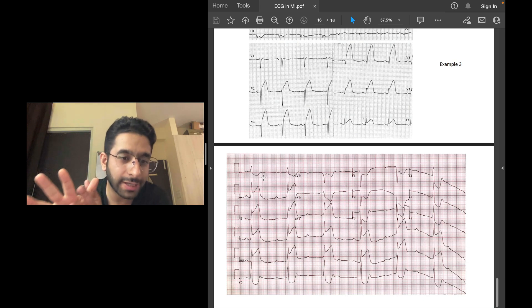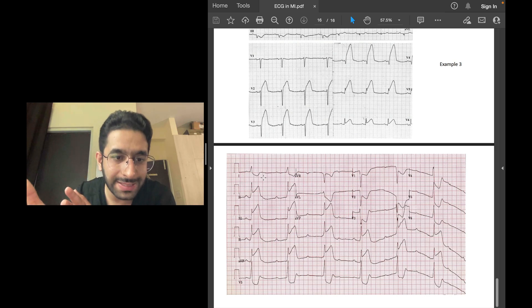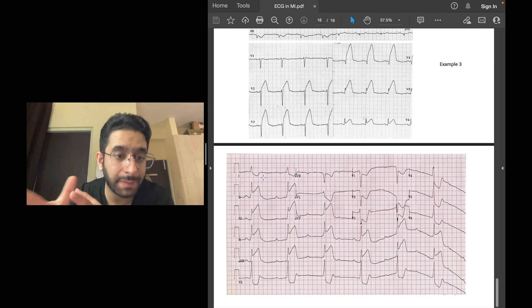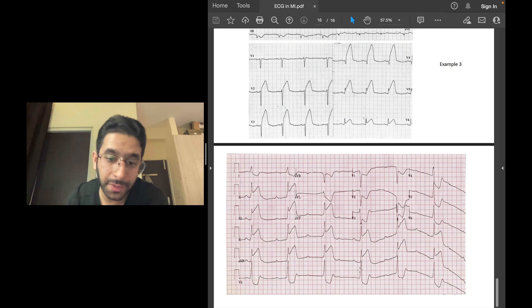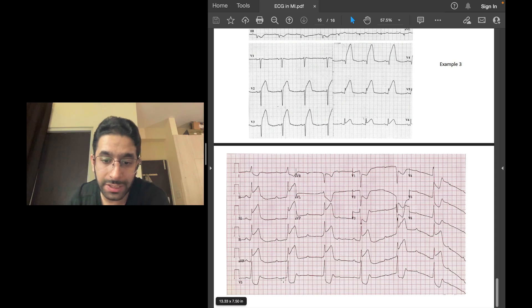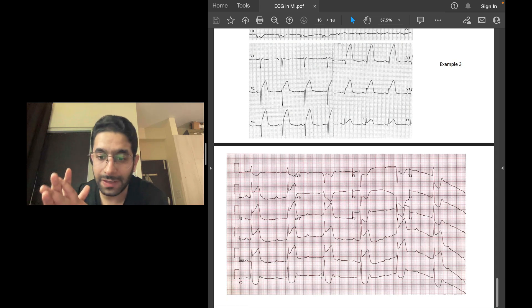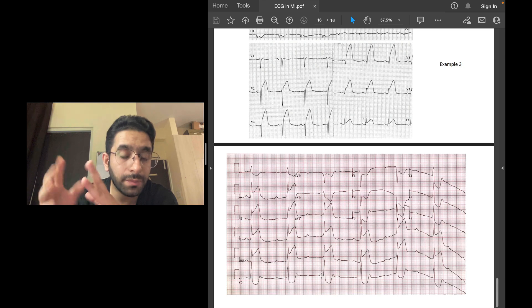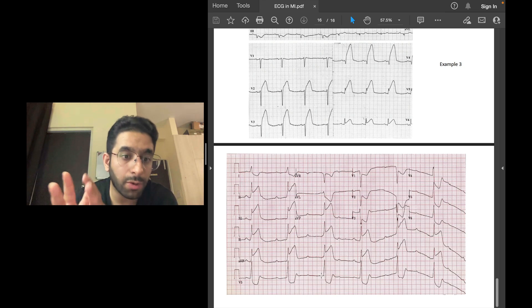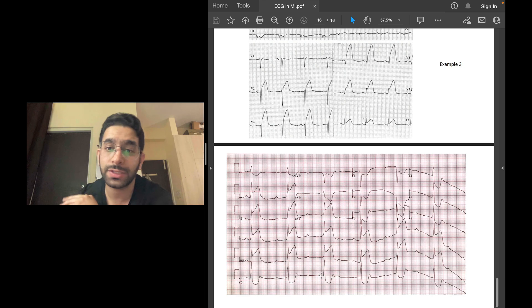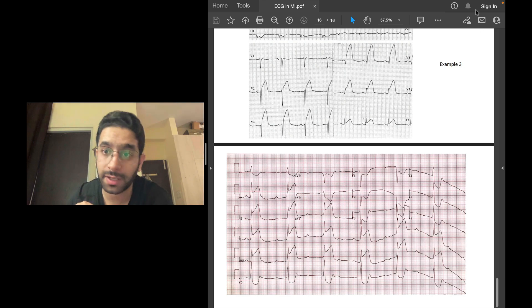The last ECG example is important. You can appreciate ST elevations in leads 2, 3, and AVF with depressions in AVL and lead 1 — inferior wall MI. But you must look at the ECG as a whole: always assess the rhythm, rate, and basic interpretation before commenting on ST segments. This ECG also shows a complete heart block — the P waves and QRS complexes are completely independent of each other. In inferior wall MI with a slow heart rate, always look for AV blocks of different degrees. Our next ECG video will cover AV blocks — stay tuned.